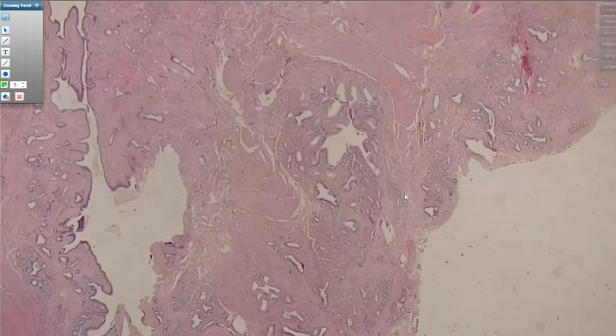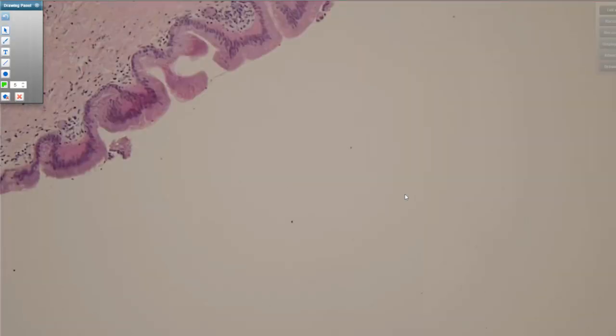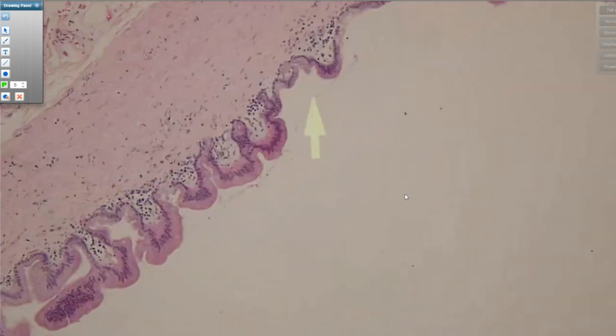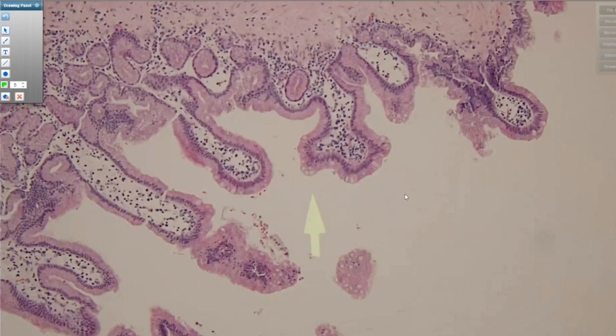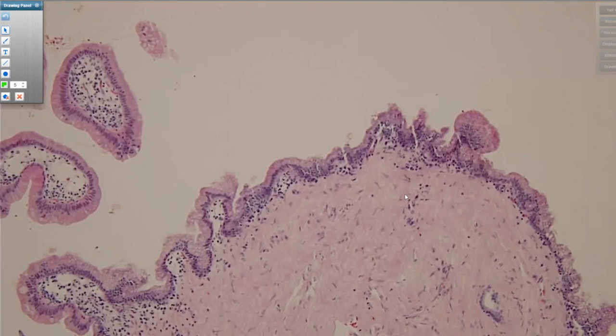I'll show you an example of a more gastric-looking IPMN here. See, in this particular example, you have a nice big pink mucinous cap that's reminiscent of foveolar type gastric mucin. You even have some little buds that look almost pyloric in nature underneath. But then you also sometimes get little goblet-like cells, and again, these can overlap, and things usually aren't strictly gastric or strictly intestinal. Often there's a mixed histologic phenotype going on.